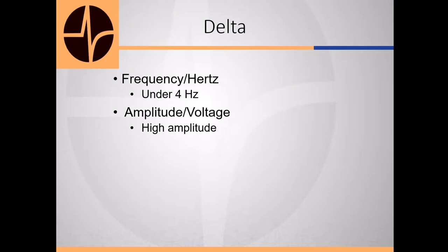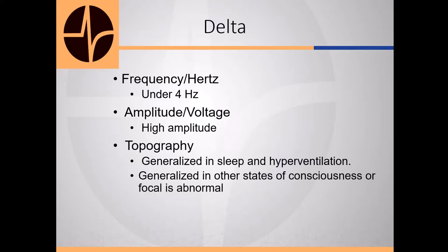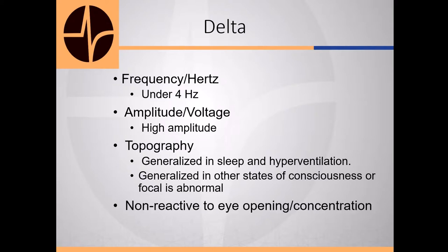The amplitude is generally high amplitude. The topography is generalized in sleep and during hyperventilation. Generalized in other states of consciousness, or if it's focal, it's abnormal. It's non-reactive to eye opening or concentration.